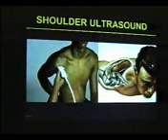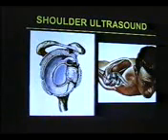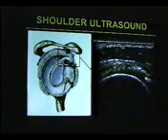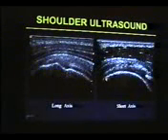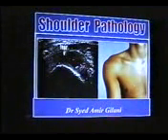While scanning the shoulder in this position, when we move a little bit to the lateral side, to the corner of the shoulder, we get the labrum. This is the area. If we scan this area we will get this type of view. Here is the labrum. The long axis and short axis of the shoulder joint. Then come the techniques with pathologies, shoulder pathologies.